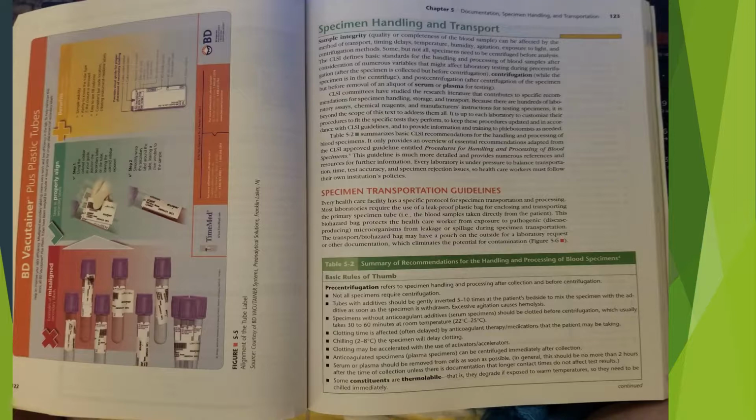Specimen transportation guidelines. Every healthcare facility has a specific protocol for specimen transportation and processing. Most laboratories require the use of a leak-proof plastic bag for enclosing and transporting the primary specimen tube, i.e., the blood samples taken directly from the patient. This biohazard bag protects the healthcare worker from exposure to pathogenic, disease-producing microorganisms from leakage or spillage during specimen transportation. The transport biohazard bag may have a pouch on the outside for laboratory requests or other documentation, which eliminates the potential for contamination.